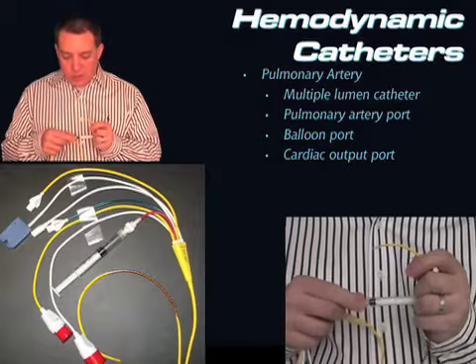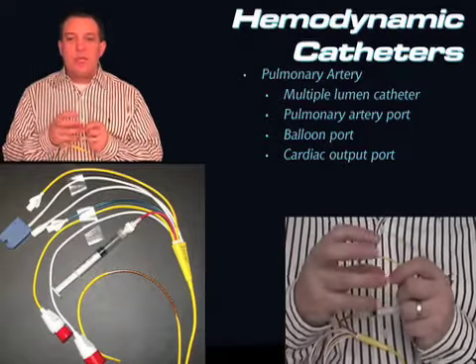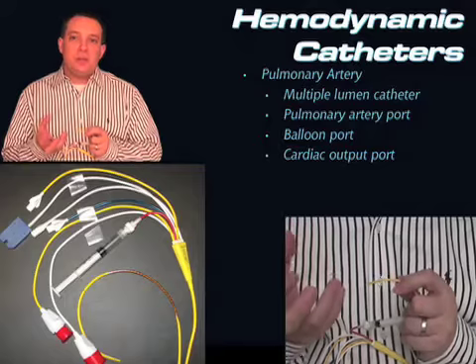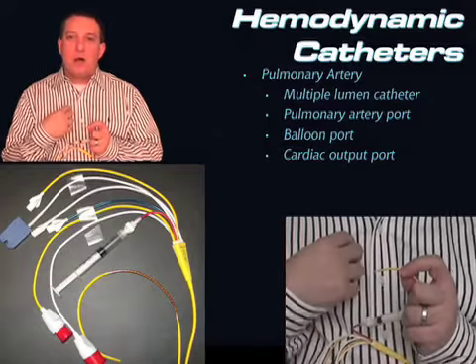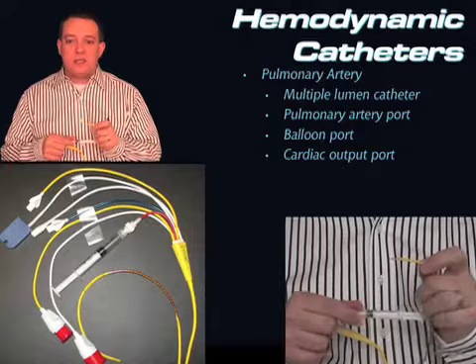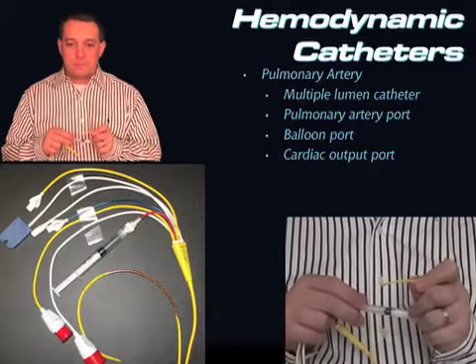The reason that's so important is because when this syringe is pushed and we've filled this balloon, as long as this balloon is inflated, what disease have we just created? Well, we've basically just created a pulmonary embolus, because as long as this balloon is inflated, we've blocked all the blood flow in that particular branch of that pulmonary artery. So we never ever want this balloon to be inflated except for when we purposely inflate it.